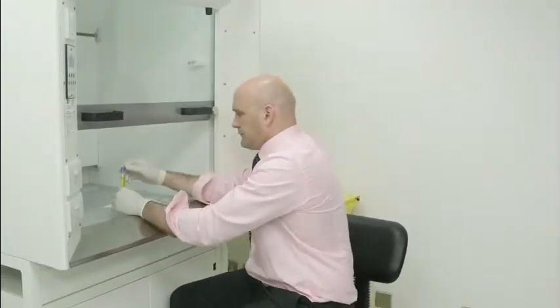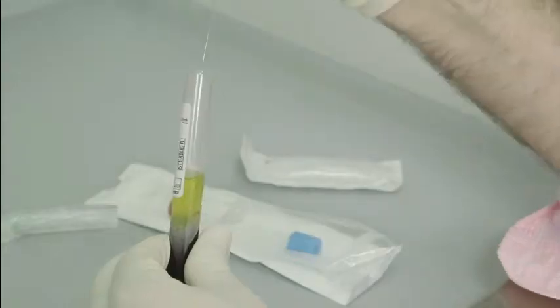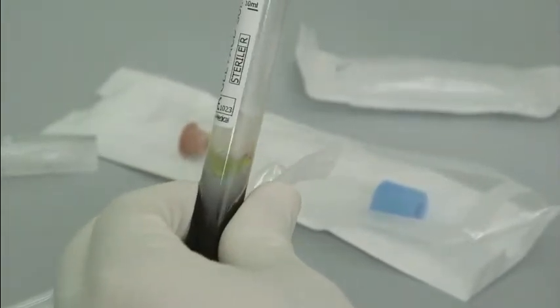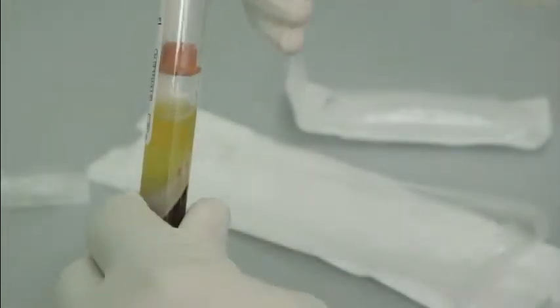On removal from the centrifuge, the area above the gel contains serum and the activated platelet clusters. The majority of serum is removed so that platelet concentration is increased.